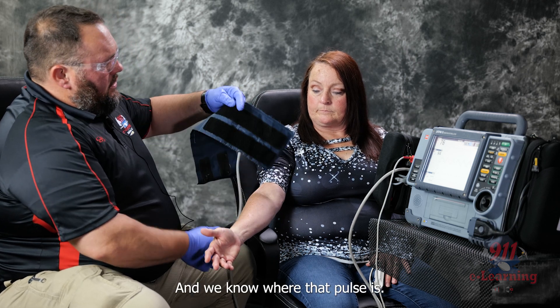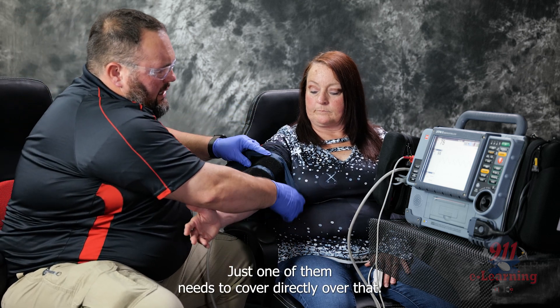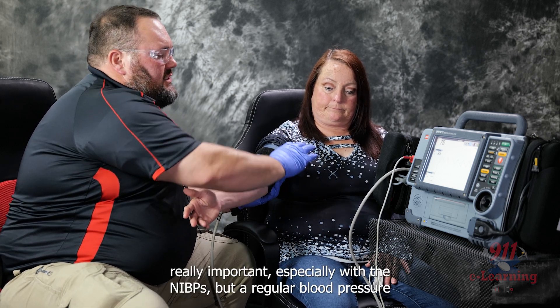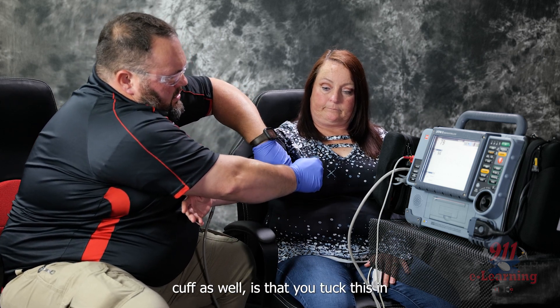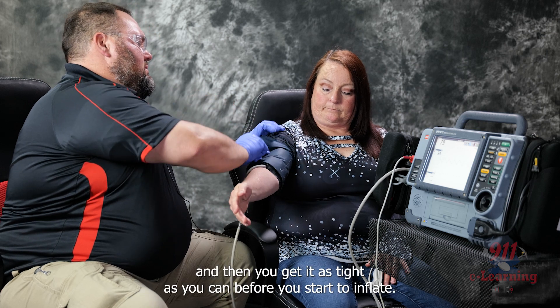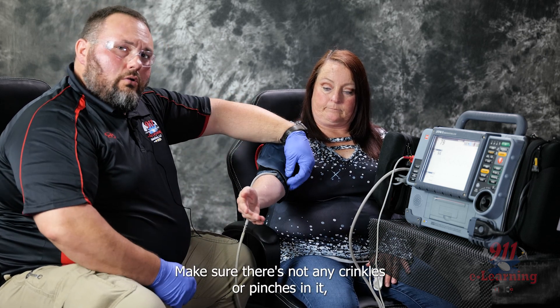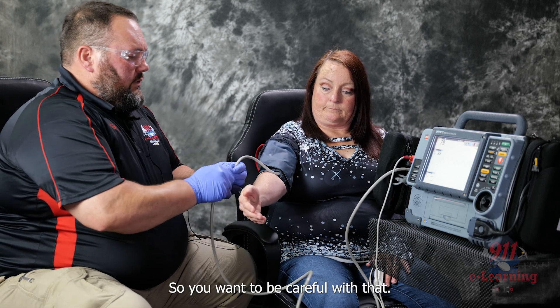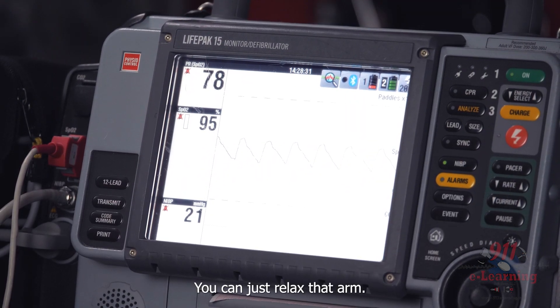Once you know where that pulse is, take your line — it doesn't matter which line you use, just one of them needs to cover directly over that artery. What's really important, especially with NIBPs but with a regular blood pressure cuff as well, is that you tuck it in and get it as tight as you can before you start to inflate. Make sure there are no crinkles or pinches in it, because that'll put pressure on the patient and can actually injure them.